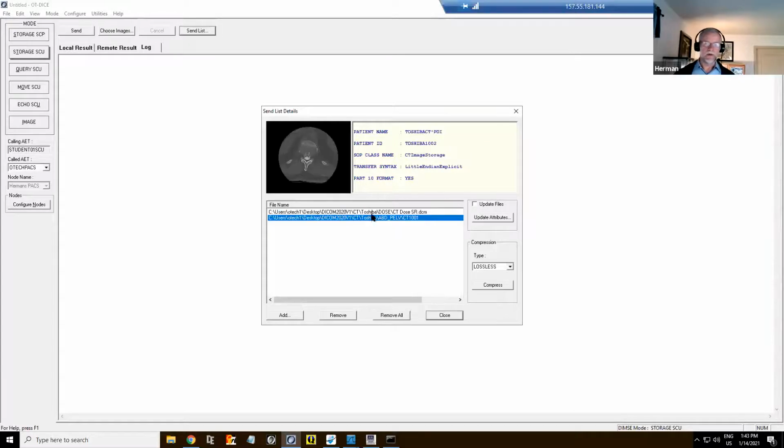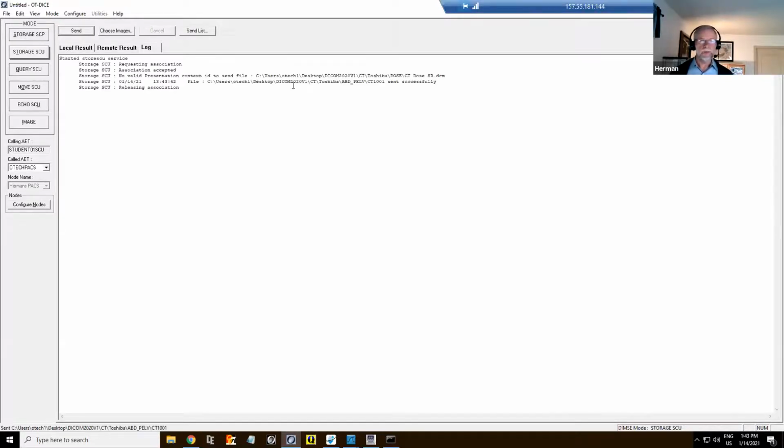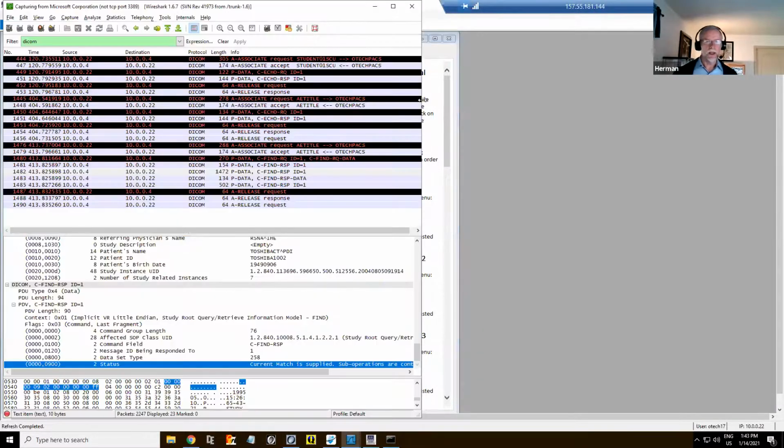This is my send list. So nothing happened yet. I just selected those two images and a CT. Close. Okay, so no problem. I send it to the PACS system. I'm still listening, so store, send, right? And okay, so what is now the communication? What is this communication that goes back and forth?